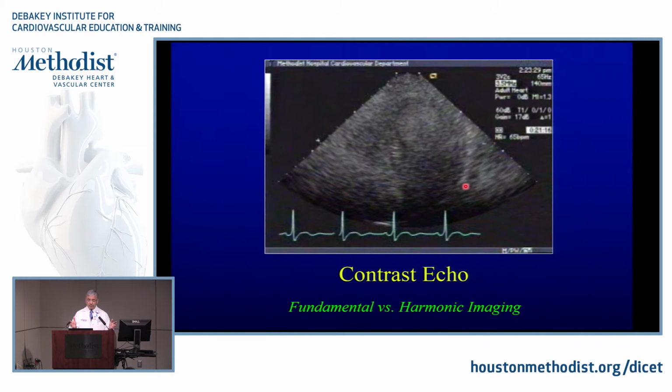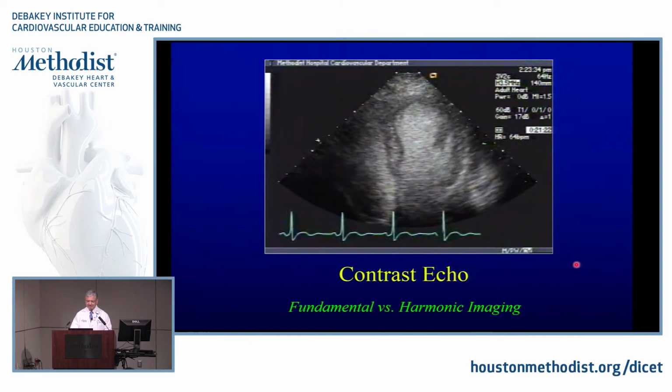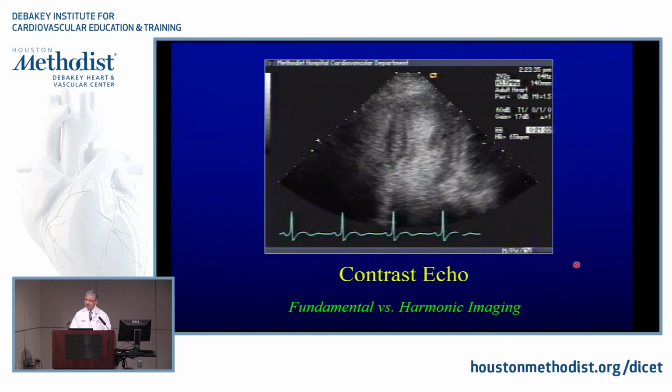This is fundamental imaging. What you're seeing there, the contrast is already there, and it's almost like myocardium. I can't tell the difference. The image is really not pretty. But once you put harmonic on, I'm emphasizing the little resonance from these tiny microbubbles. The signal from harmonic goes up significantly compared to muscle, okay? Let's see it. Fundamental, harmonic, fundamental, harmonic. Quite a difference. Yes, Jeff.